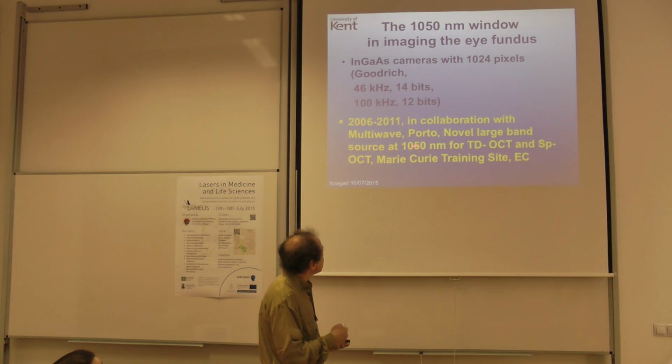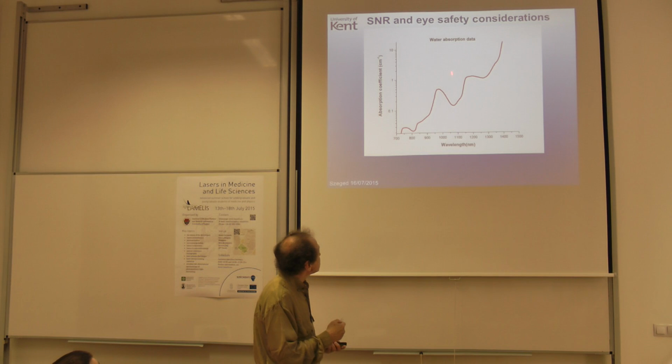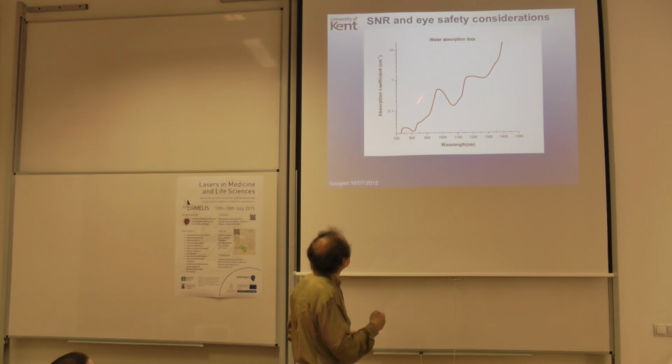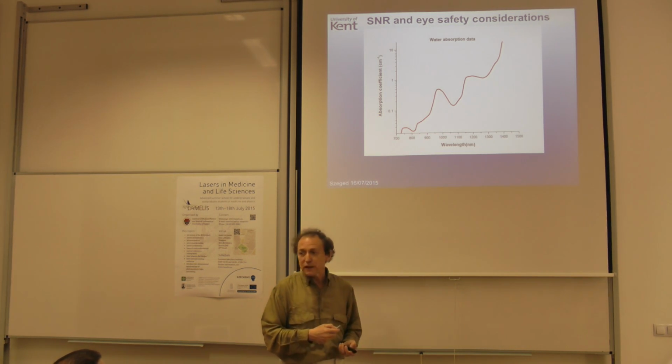So we targeted these wavelengths. For these wavelengths, why is this wavelength very good for imaging the retina? There have been many curves presented yesterday by Professor Lichi, and one of them was the absorption of water, and you see it here. So mainly OCT evolved for imaging the retina in this range of 750 to 900. That's where time domain started.